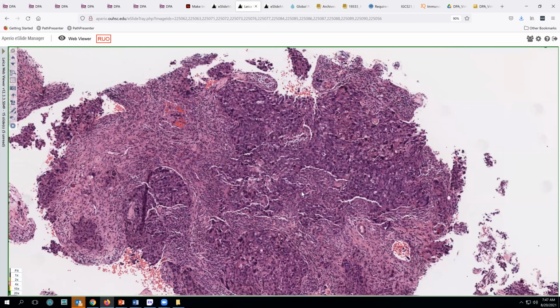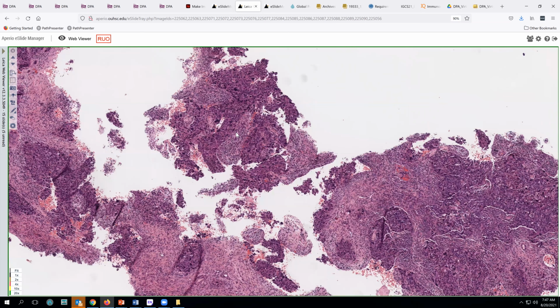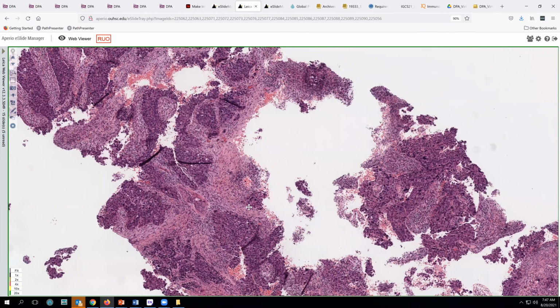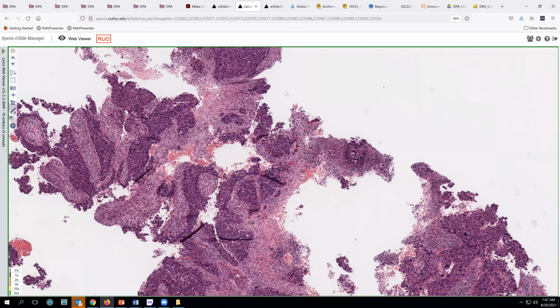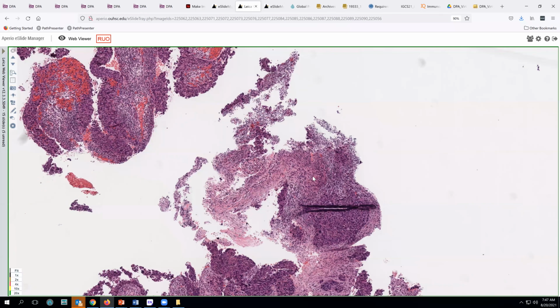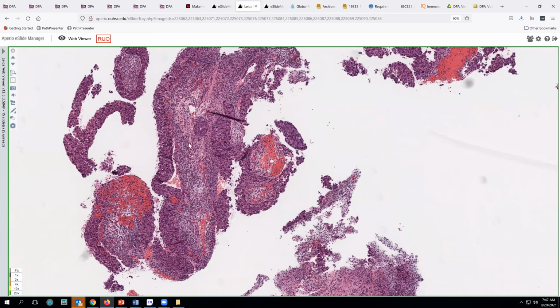And not surprisingly, these are often the tumors that are triple negative, negative for estrogen receptor, negative for progesterone, and negative for HER2. So certainly a high-risk case underscored by both the histology and the prognostic markers that we routinely employ. So it's always, as I said, good to correlate those findings and fit those together.